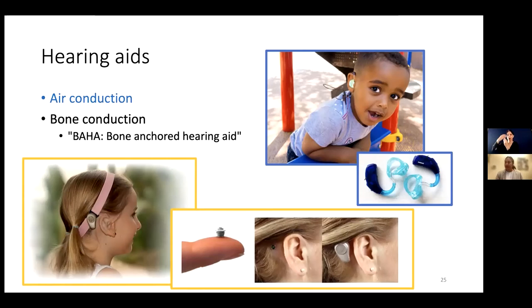like an absent outer ear or no opening to the ear canal, like the girl in the photo. It can also be used when a child has an ear that is just constantly draining due to chronic ear infections, or if there are other middle or outer ear differences that don't make a conventional air conduction hearing aid feasible. In kids, a bone conduction hearing device is worn on a headband, and in older age, a screw can be surgically implanted so that the hearing aid can directly snap on to the head without having to wear a headband.